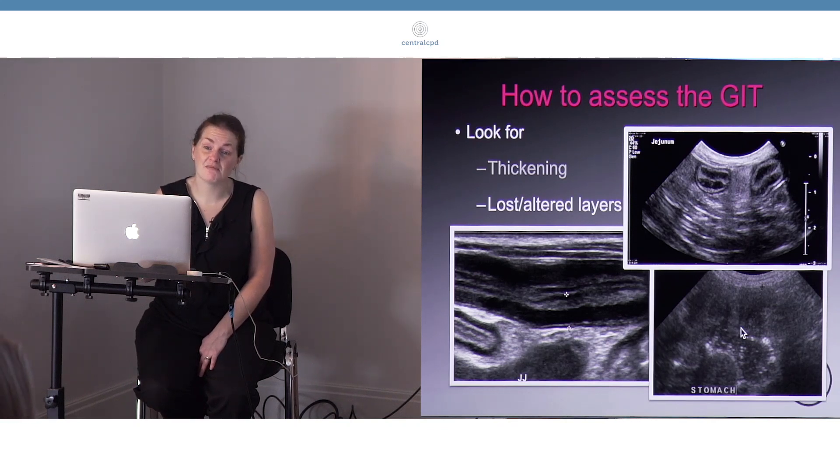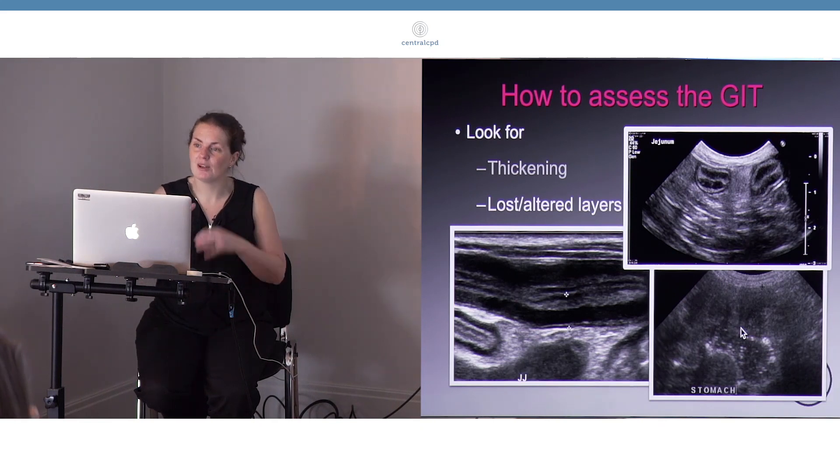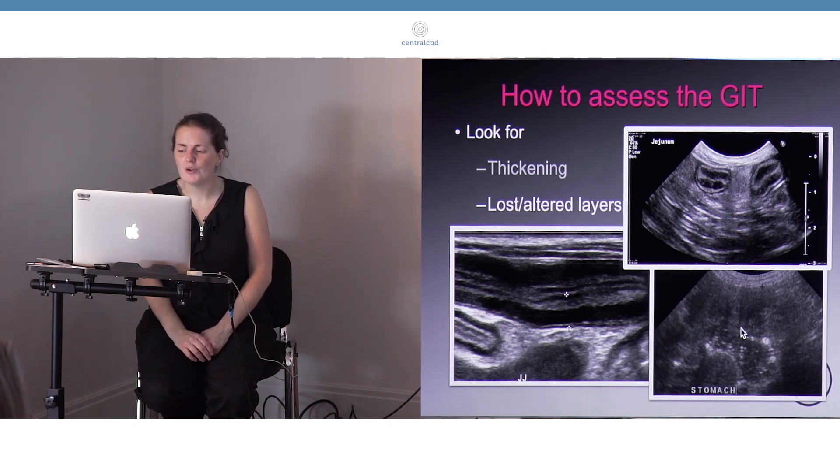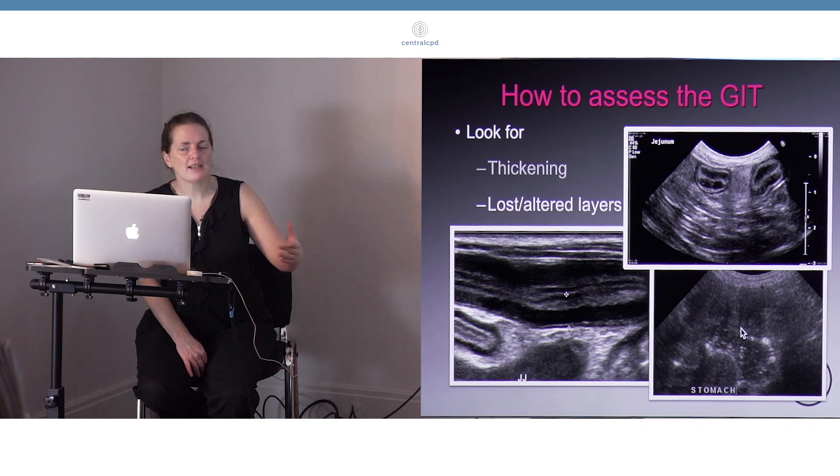There are a few inflammatory conditions, very severe intestinal inflammation, where you're getting inflammatory cells that will infiltrate and will lose the layering. But that complete loss is a bit of a hallmark of neoplasia.